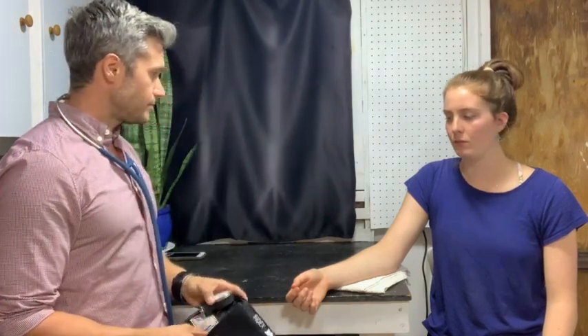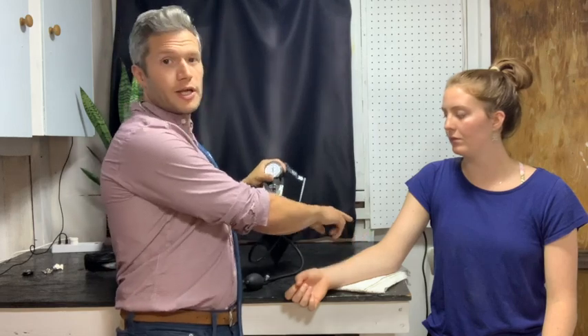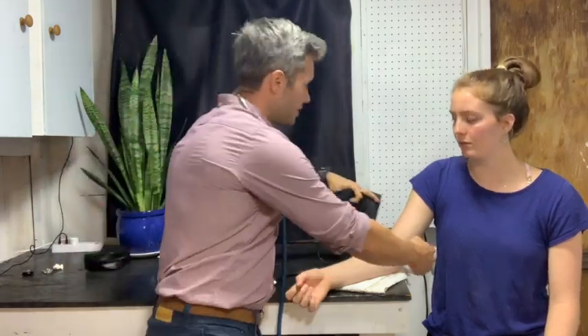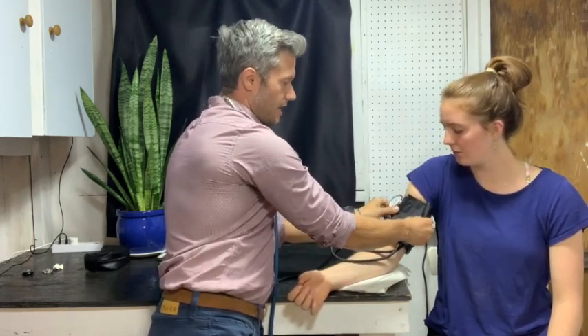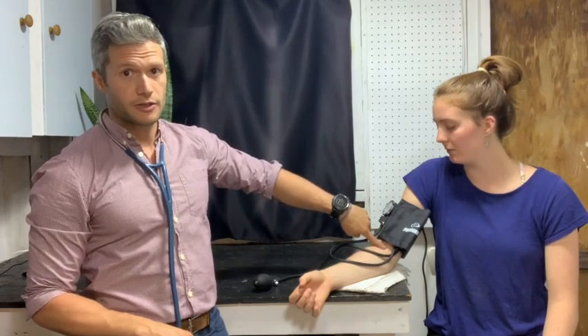From here we can start getting ready and set up to apply the cuff. I'm going to line this arrow up with her brachial artery — if you want a good picture of where that is, check out the lecture portion. The other thing I'm going to do, which is part of the activity you've done just before the blood pressure one, is find Tully's radial pulse. Getting the cuff on — some people it'll slide, some people it won't. I like to keep the Velcro tidy — I'm going to fold this up just to try and keep it out of the way. As long as it's holding and not dropping down to her forearm, the position is going to be okay. One of the main reasons I don't want it dropping down to her forearm is that I'm going to try to use the stethoscope drum to hear her brachial artery right in her elbow crease. If the cuff slides down, it's going to block that.